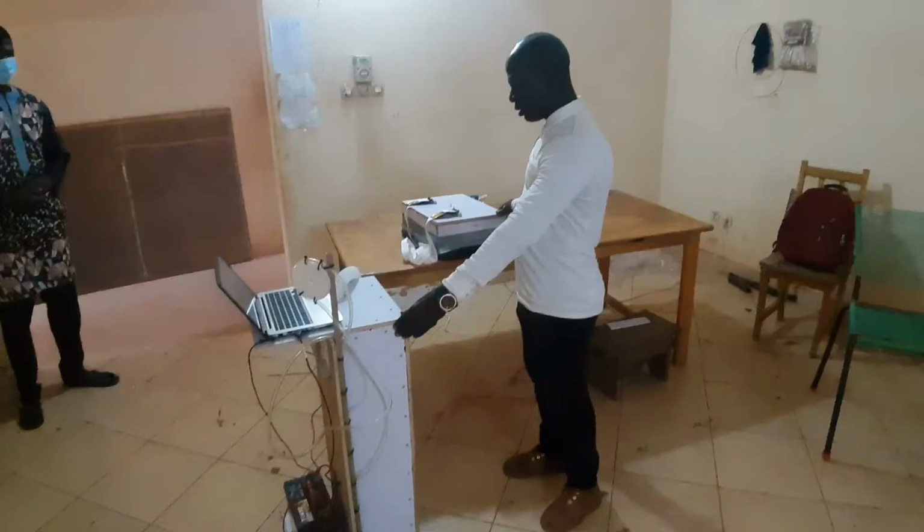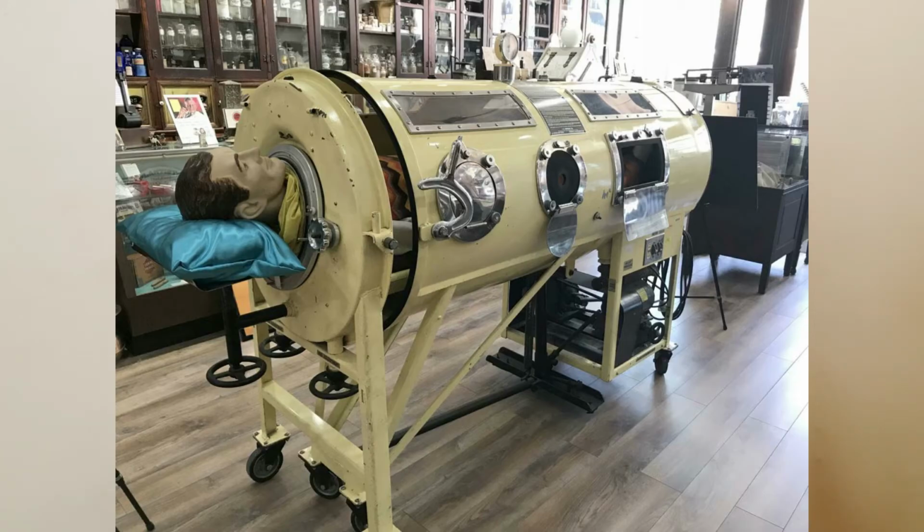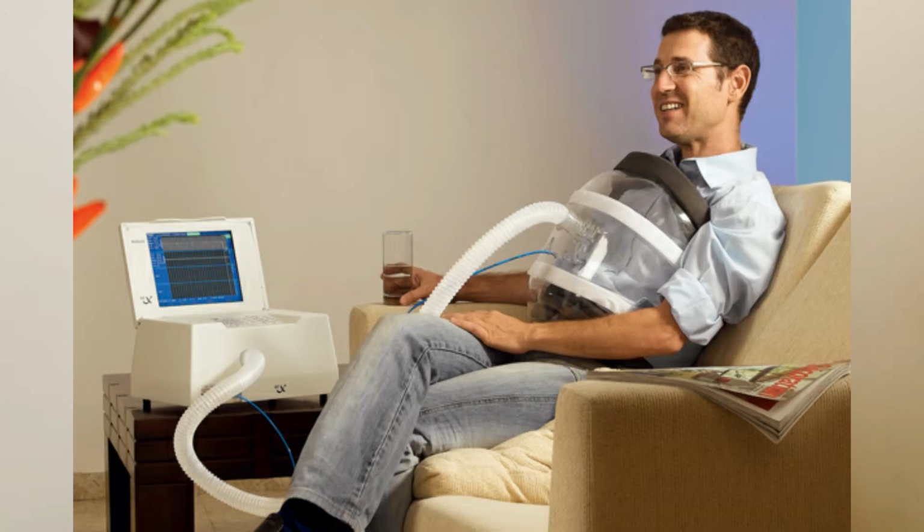The Kabako ventilator is what is called a negative pressure ventilator, and it can be used by minimally trained medical staff. The first negative pressure ventilators were the iron lungs, built in the 1940s for polio victims. Negative pressure ventilators have been modernized since the iron lung days.